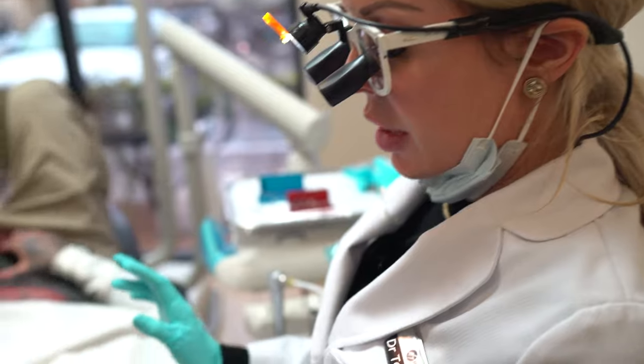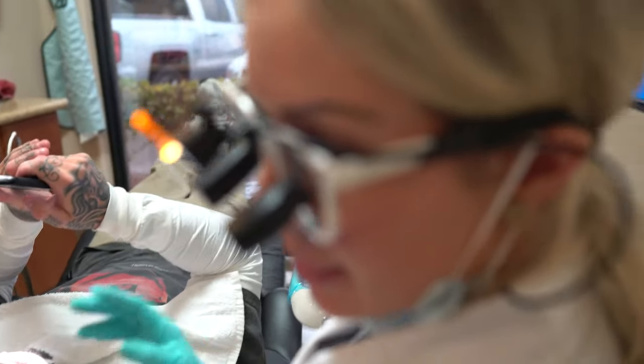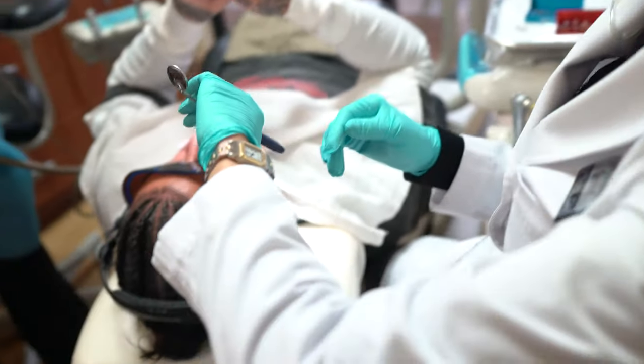Take those out while I'm trimming those up, we'll go ahead and pack the cord and get his final impression. By the time that's done, we'll get his temporaries on and he's done. We are two hours in, so maybe another hour — three hours total.